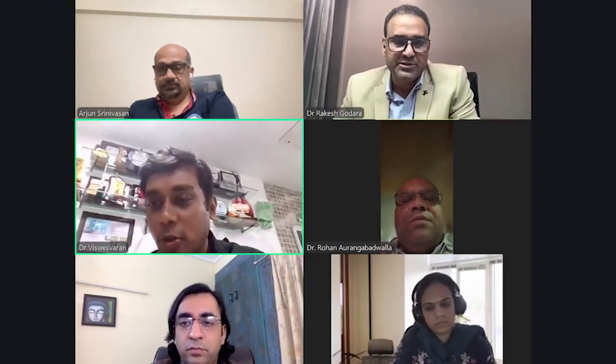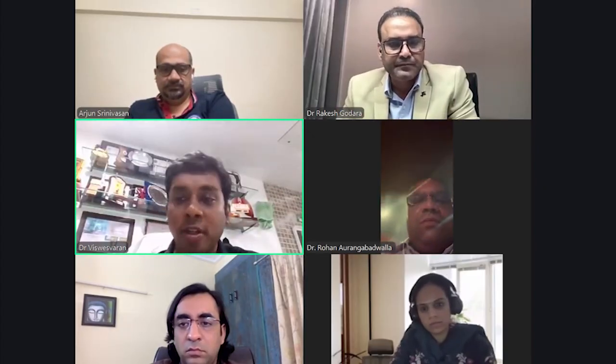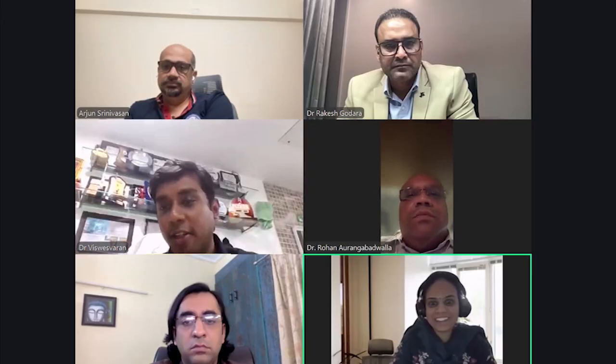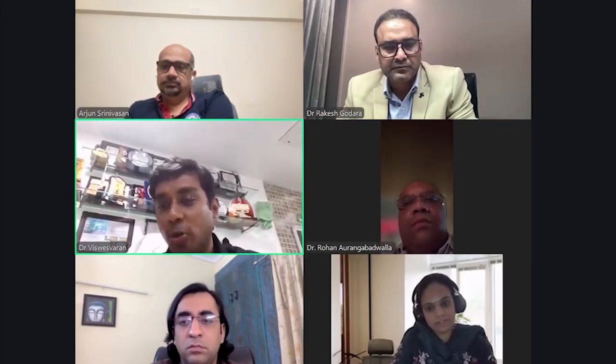True, very true. And scope damage also. True. Dr. Kunal from Kanpur, this question is to Dr. Divya. Why is cryotherapy ineffective in a pure extrinsic airway compression? It is, yeah. There's nothing to debulk there. Exactly. You don't have anything to work with inside your working channel. It's all outside your working channel.